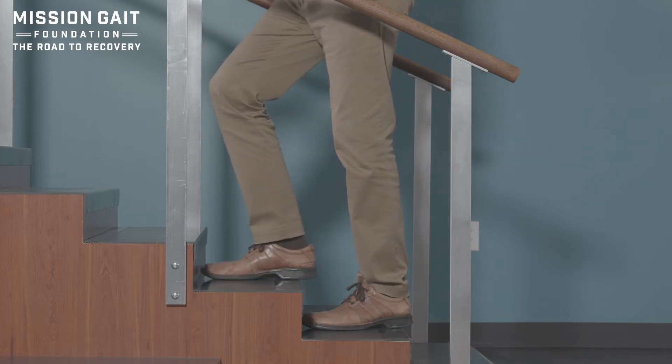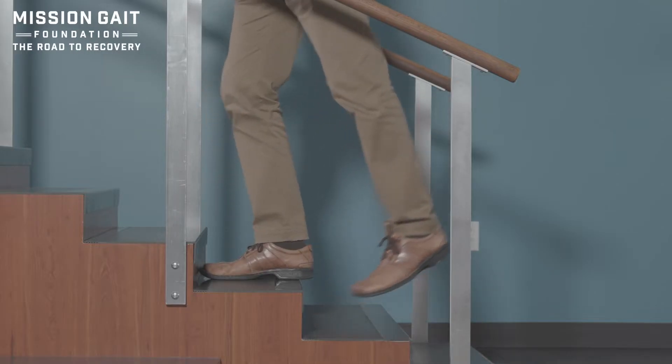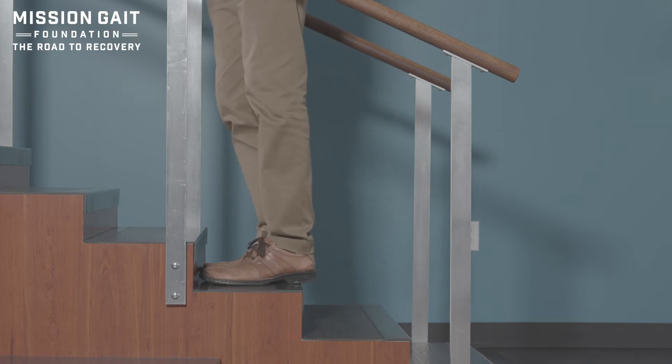When going up one step at a time, going up is purely about power. Coming down is more about control. Coming up, as long as I lean into it, step up, clear the toe and come into place.